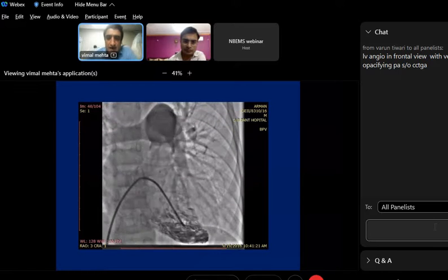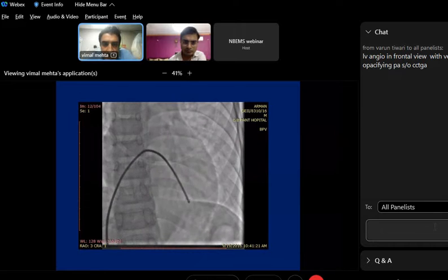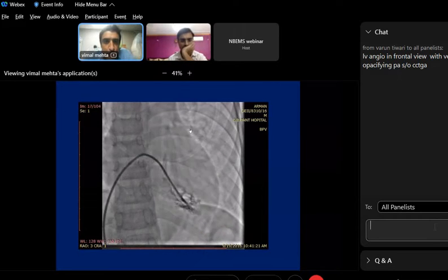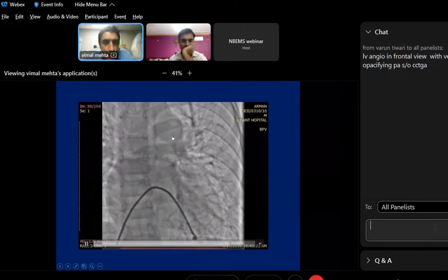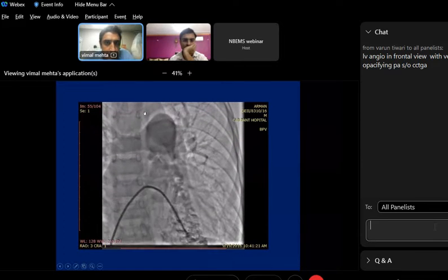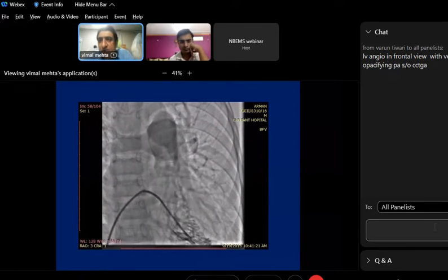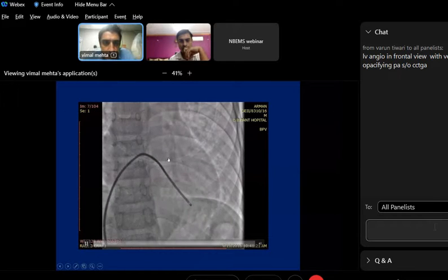Here the anatomical views come, what I was telling earlier on, that in this view, if your catheter is in the left ventricle, you will have almost similar kind of picture. However, there are a few aspects to be mentioned, that only one great vessel is getting opacified. That is the pulmonary artery, MPA, and left and right pulmonary artery. You can see the opacification. So there is no ventricular septal defect. And this is classical pulmonary stenosis.